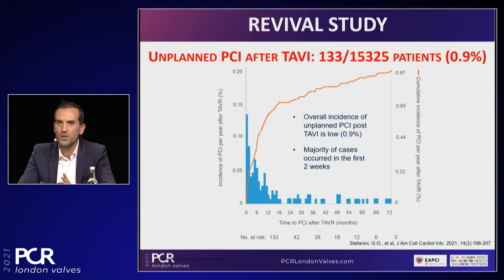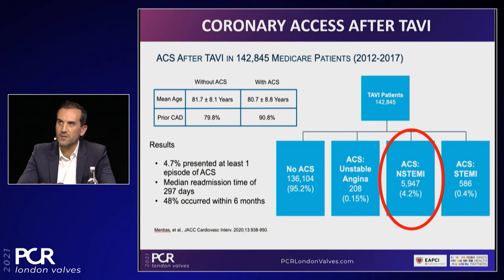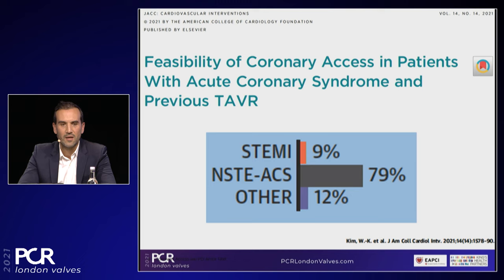An interesting finding from this study is that although the distribution was 36% balloon-expandable valves and 64% self-expandable valves, there was no difference in the success rate of cannulation depending on the type of valve, and the overall success rate of PCI was around 96%. Now, saying a little bit more about the indication, because we said how often it was necessary, but why is it necessary? More or less in the acute phase, it's for acute coronary syndrome, mainly, and you see that in that very high-number patient registry, and also in this other study, it's for non-ST elevation myocardial infarction, and oppositely in the long term for chronic coronary syndrome.